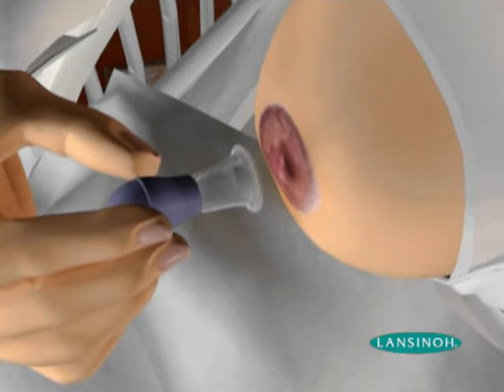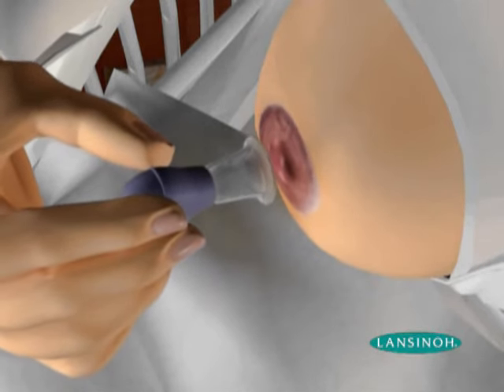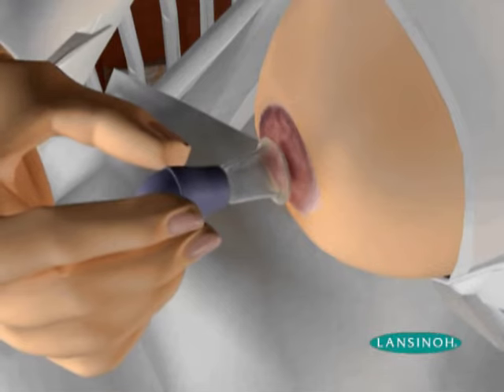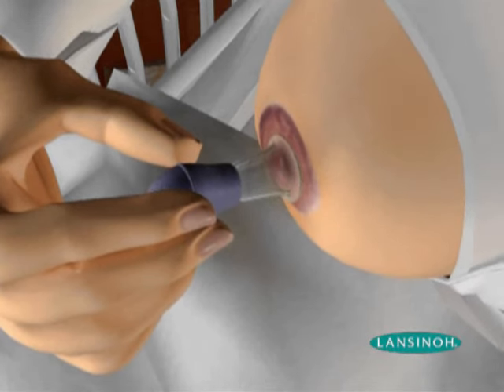Gently squeeze the bulb and place the shield over your nipple. Lightly press the shield down against the skin to ensure an airtight seal. Gently push the shield slightly into the breast, being careful to avoid pain.